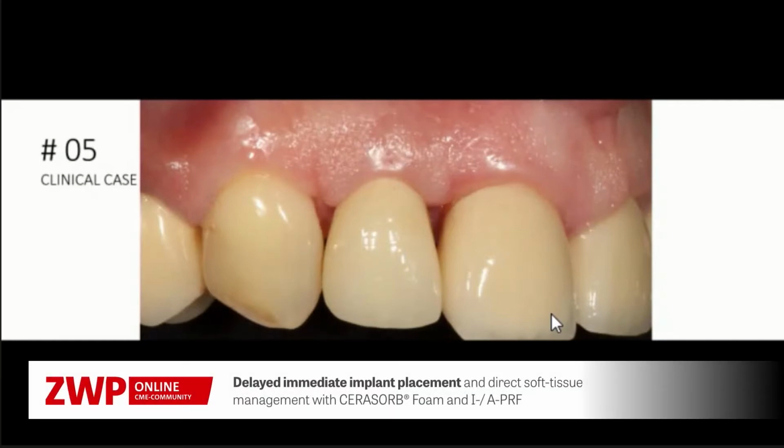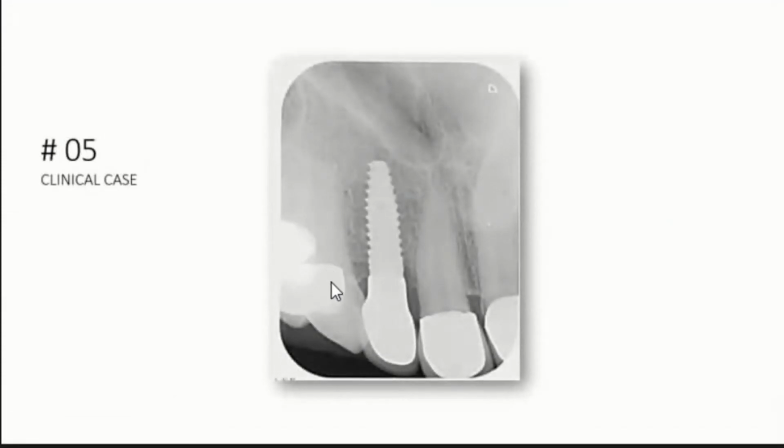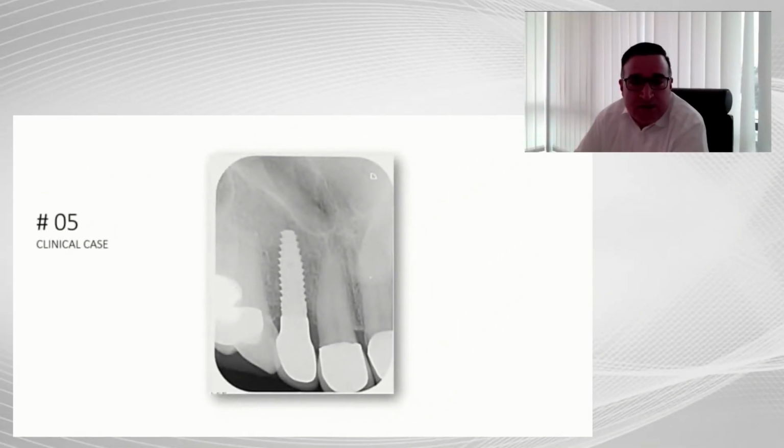There is still a lot of potential in the soft tissue, and we expect further positive remodeling of the papillae here. We are continuing to monitor and follow up this case and updating the clinical status. And then here you can see our X-ray image, very nice bone structures that we can find here.